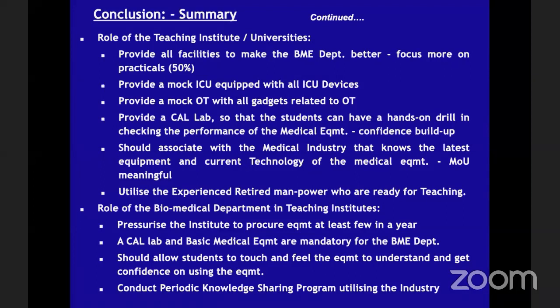You also should have a mock OT. A mock OT means an OT like the OT. How many biomedical engineers have gone into the OT to see what an OT is? What is the theater like? What is the lux of the theater like? What should be the lux of a neurology department, neurosurgery? Everything they should get to know. And you can also have a lux meter to see what is the lux emitted by the theater light. So this is very important. The teaching institute is supposed to have all this.